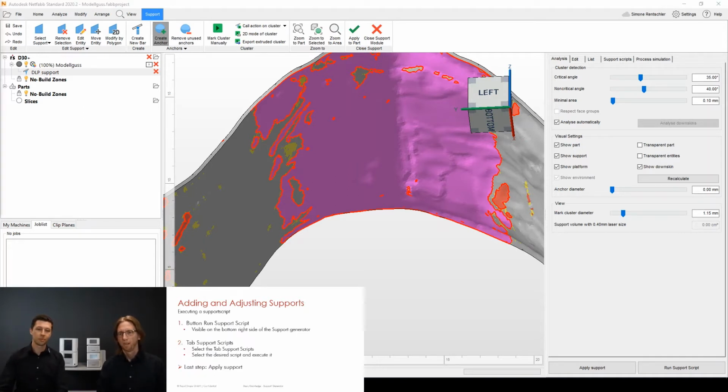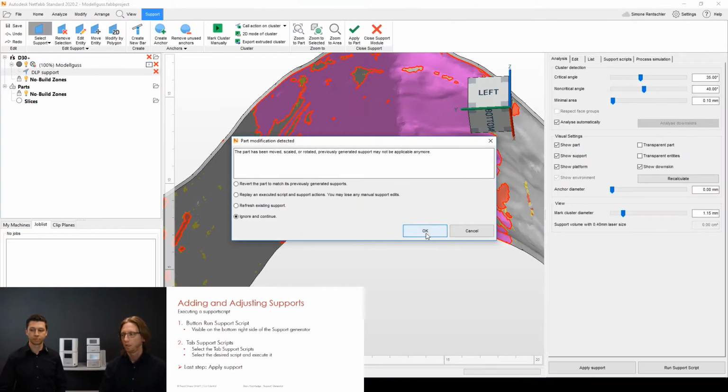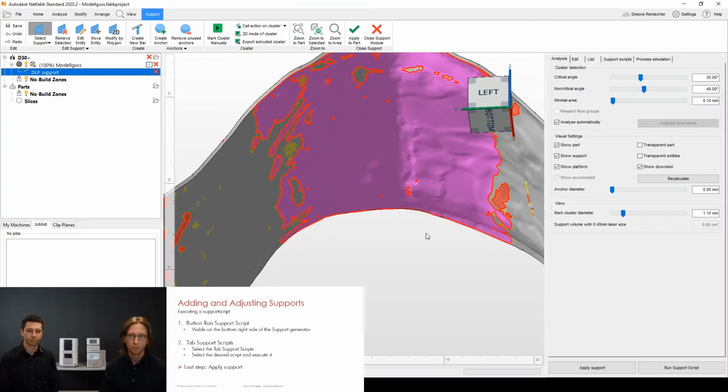All right, so let me talk a little bit about executing a support script. There are 2 ways to perform this actually. So remember that this was previously done in the machine environment. So if you go back in the machine environment, this was just done with the add support and then using the support script. However, if you already work here in the support generator, you're still able to perform the support script in there. So what you do here is you have again 2 options.